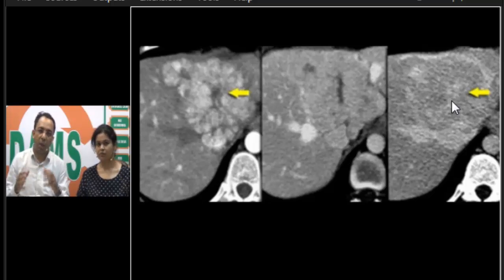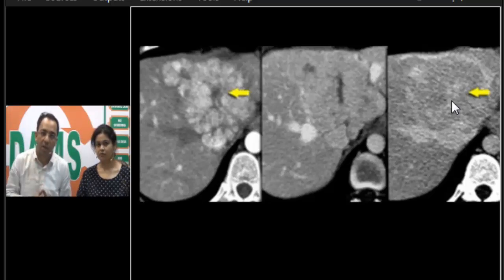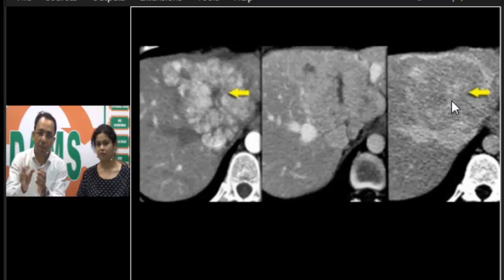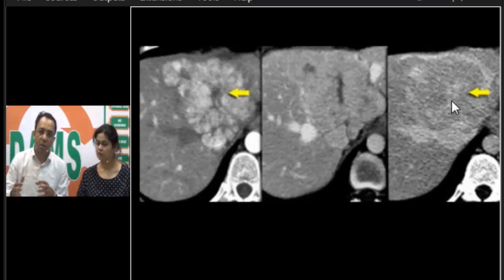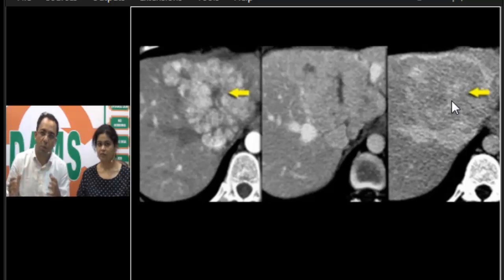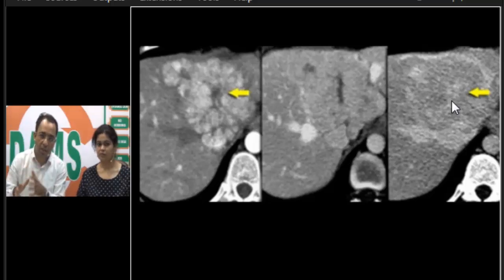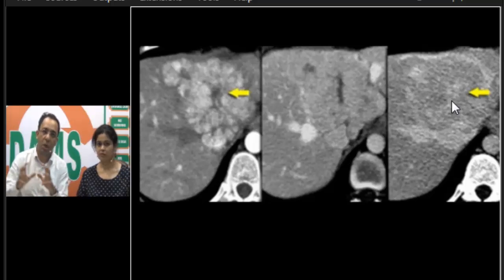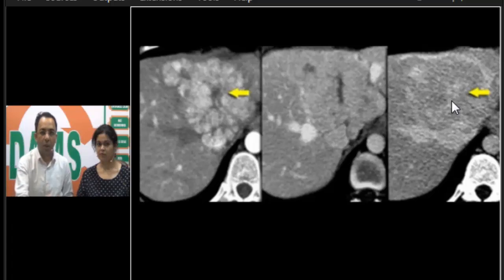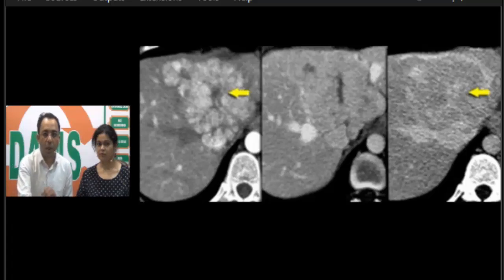Hepatic adenoma, on the other hand, would not have a central scar — it may have a pseudofibrous capsule. Adenomas are more likely to bleed, so you may see an associated subcapsular hematoma, fat deposition, or fatty attenuation on CT. This is how we differentiate these lesions.